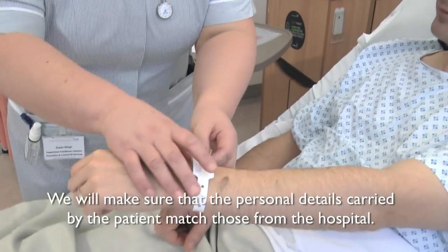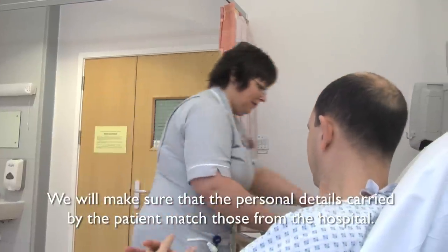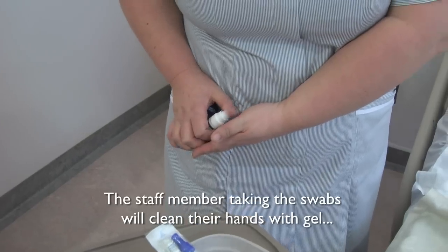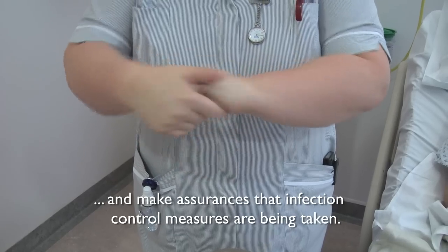Before we take the swabs for MRSA screening, we need to make sure that the personal details carried by the patient match those held by the hospital. The nurse will write these details down on the form and swabs before any samples are taken. The staff member taking the swabs will clean their hands with gel. This will reduce the risk of cross-contamination and give assurance that infection control measures are being observed.